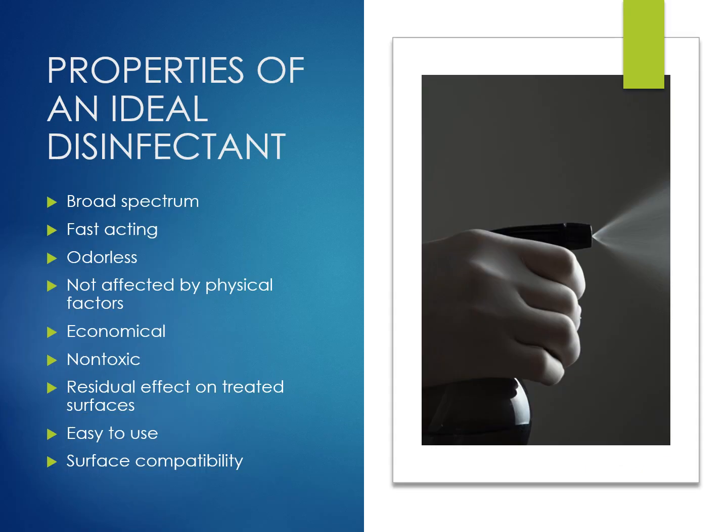And these are some of the properties, just to review, of an ideal disinfectant. We want it to be very broad spectrum, just like we were mentioning, effective against the different microorganisms. We want it to be fast acting, odorless, not affected by physical factors, especially where our wipes come into play. We used to use the spray-wipe-spray method, but a lot of times because of the aerosols in the air, people were having problems, especially people with asthma, or they develop breathing difficulties.